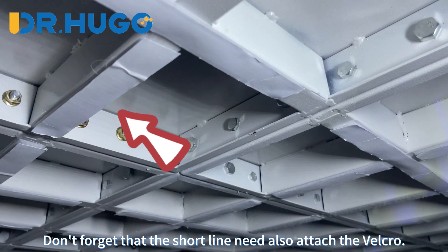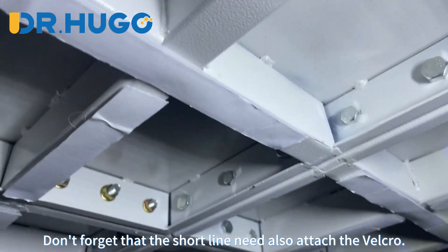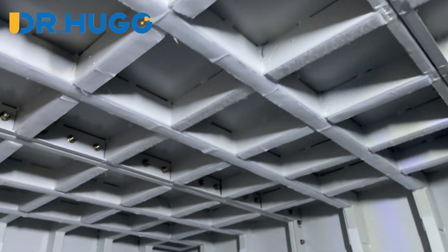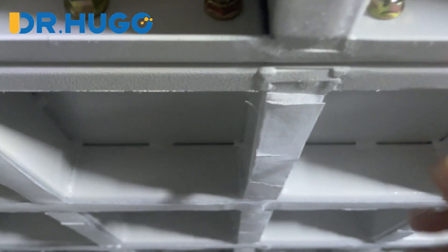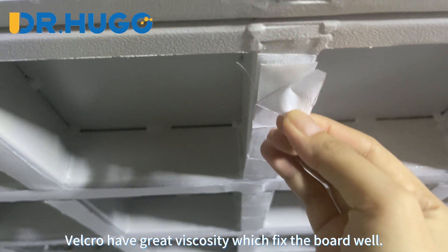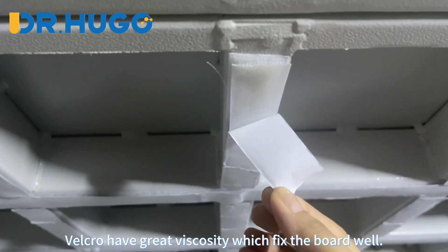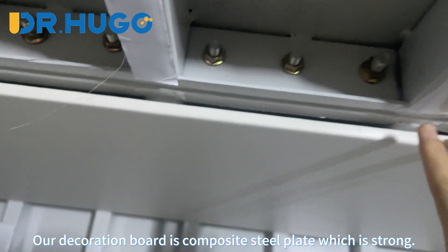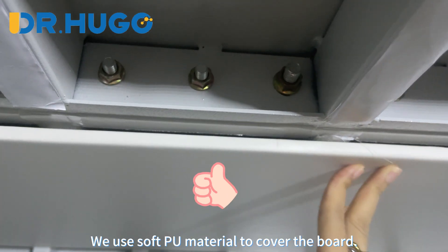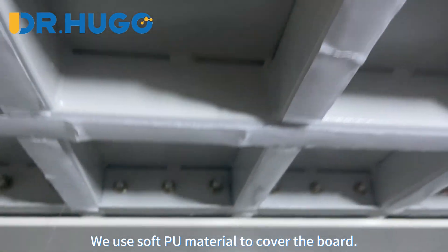Don't forget that the short lines also need velcro attached. Tear it down like this. The velcro has great viscosity which fixes the board well. Our decoration board is composite steel plate which is strong, and we use soft PU material to cover the board.